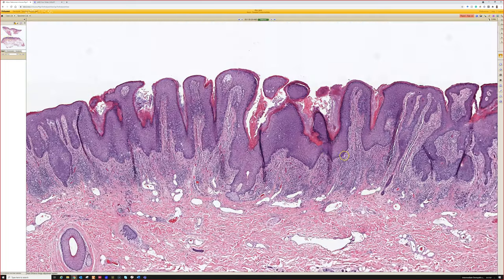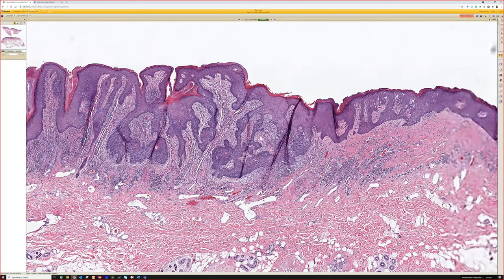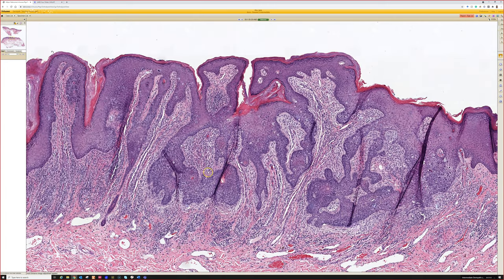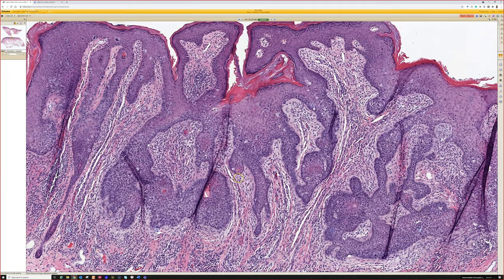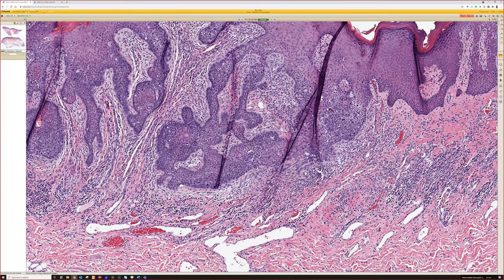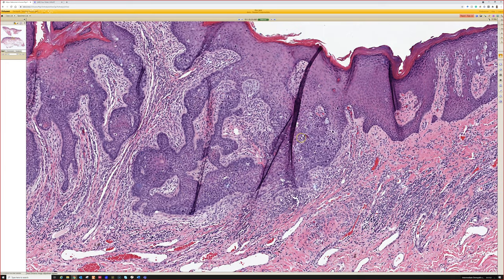And this one's kind of weird because I don't know what's going on with the epidermis here. It looks almost like basal cell carcinoma or something. I kind of wonder if this is a weird form of epidermal induction. I don't know the history of this case because it's from Dr. Ferringer's study set, but it reminds me of the basaloid induction you can see over top of a dermatofibroma.